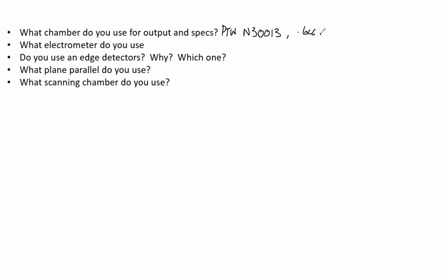So now, and this is getting a little into the weeds, but for my exam, I remembered it because you never know what they're going to ask. And if you roll off, oh, the leakage is 4e to the negative 14th amps, they're going to be like, oh, wow, you really know your ion chamber. And then our factor here for TG51, this is also good to know, just in general. It doesn't have to be exact. Ours, I looked it up, 5.3e to the 7 gray per coulomb. So that gives you a good idea. That's probably all the numbers you need to know for it.